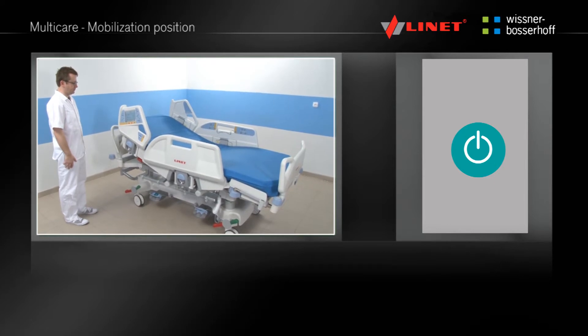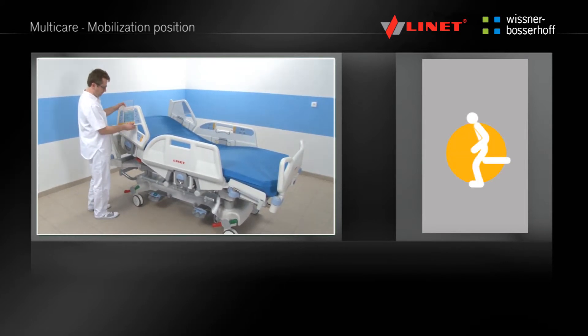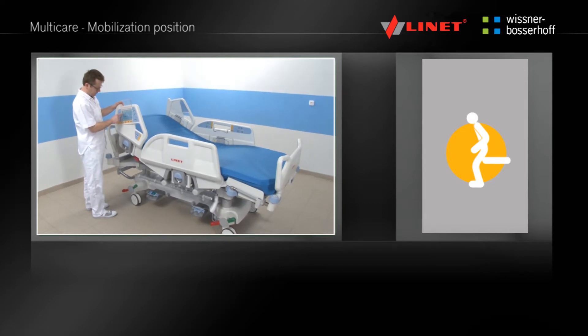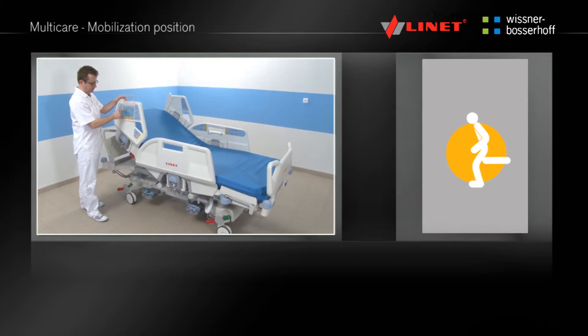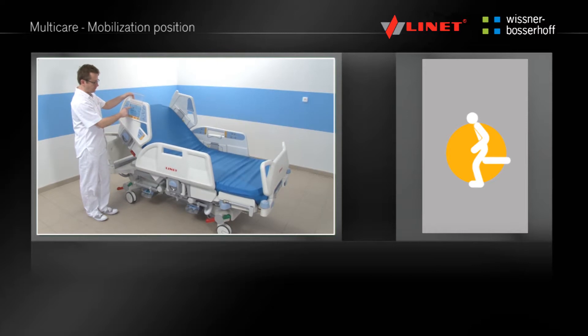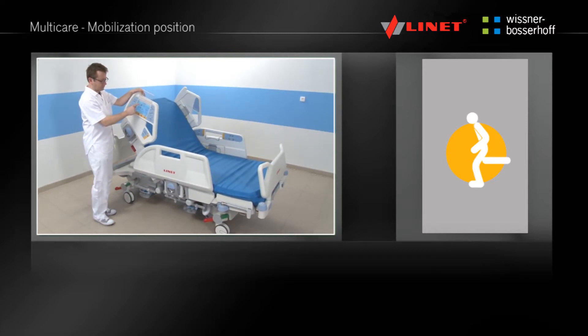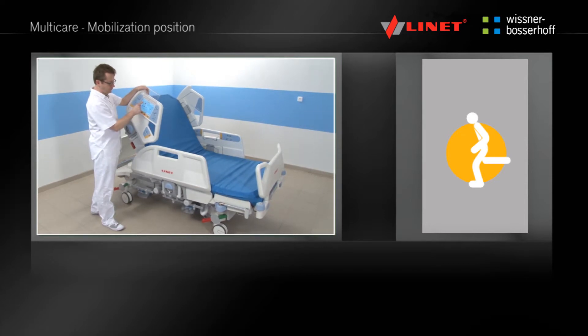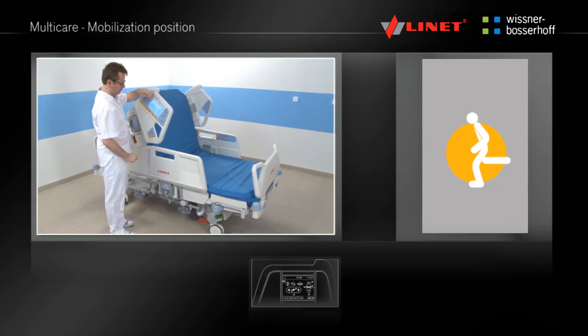Activate the function by pressing the Go button. Press and hold the pre-programmed function button until the mobilization position is reached. The backrest is positioned to the maximum angle so that the head side rail serves as support for the patient. At the same time the bed is positioned to the minimum height so that the patient can stand up with ease and safety. This function is only located on the multiboard.